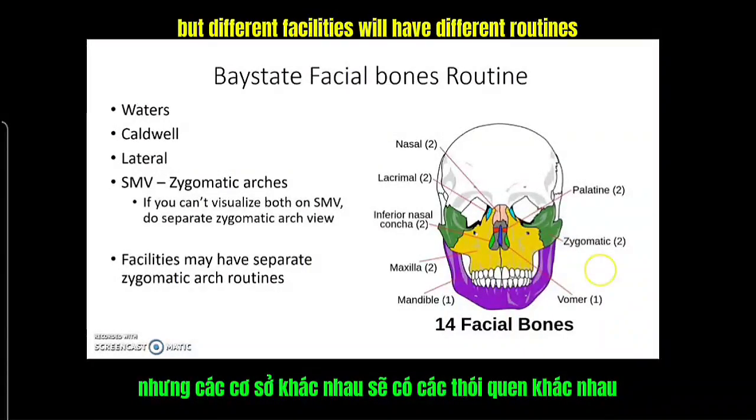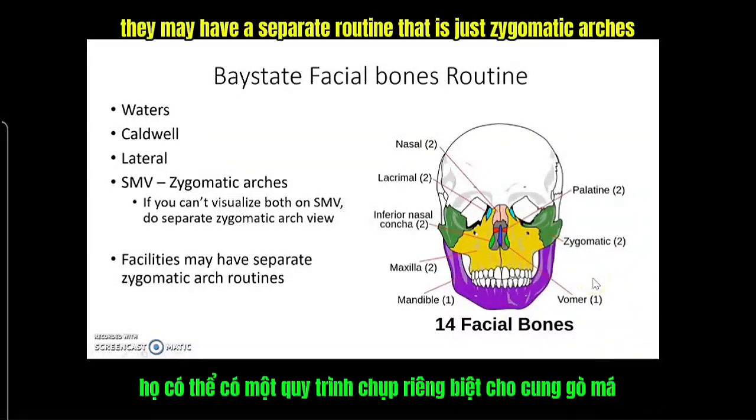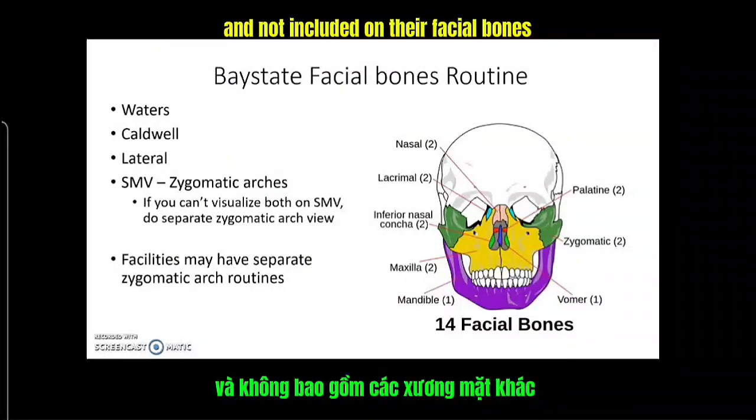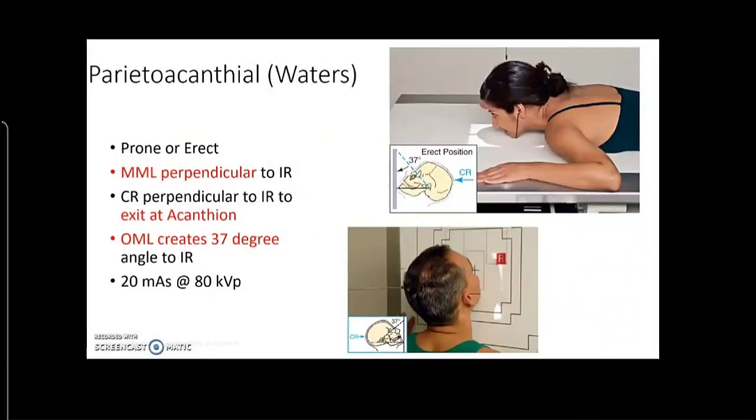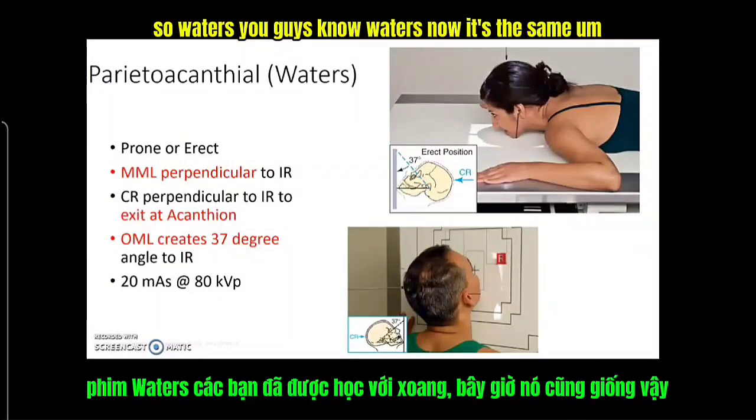But different facilities will have different routines. They may have a separate routine that is just zygomatic arches and not included on their facial bones. So make sure you check your routines for wherever you're working. So Waters, you guys know Waters now.